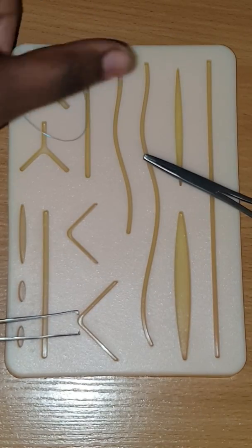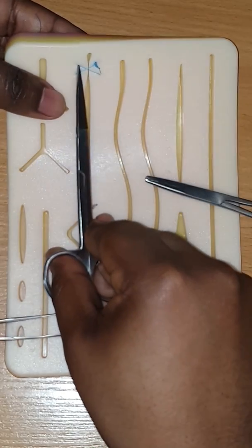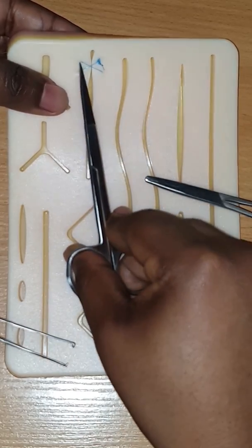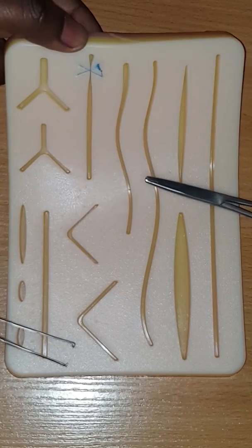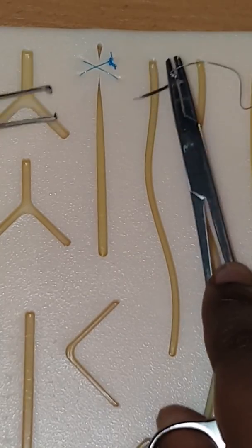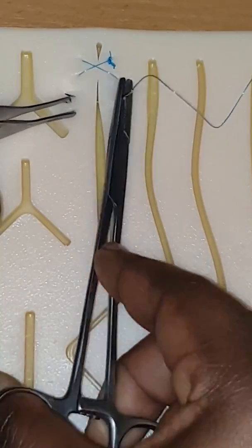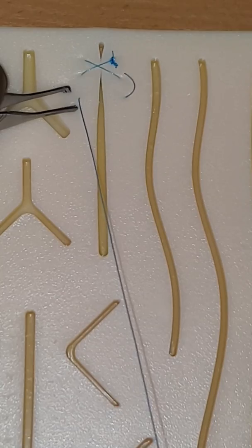I'm going to go ahead and cut. You can see the suture pad has been used a lot of times, so there's a hole over there already and it made the suture a little rough — but we're going to go ahead and continue. Let me zoom in. Now we'll slide the next suture in, equal distance, and pull it through — leave the tail.